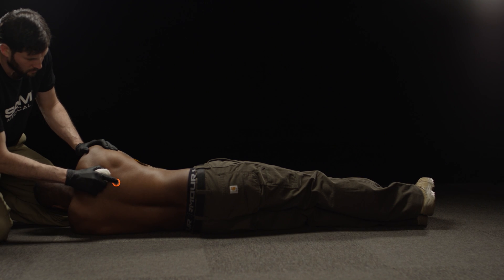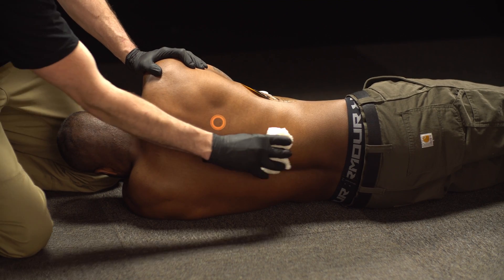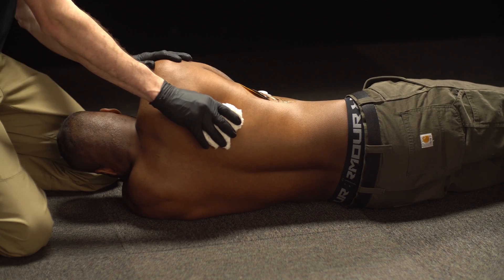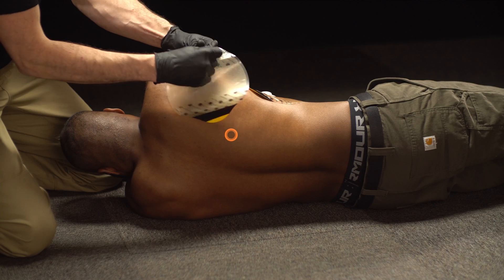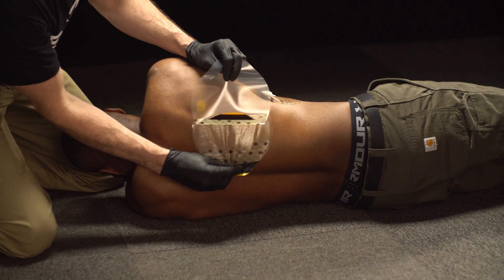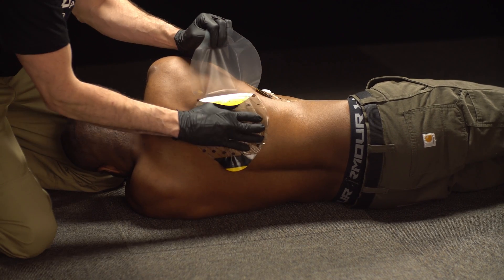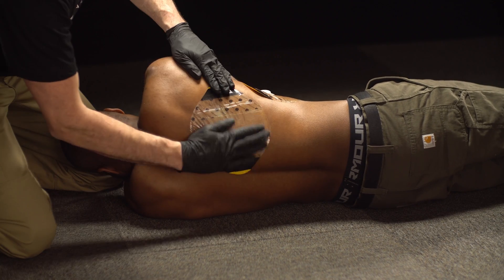Locate the wound and remove the casualty's clothes. Clean the wounded area. Next, grip the application tab and remove the clear liner. Center the dressing over the wound and place the adhesive side down before pressing firmly across its entire surface to ensure adhesion.